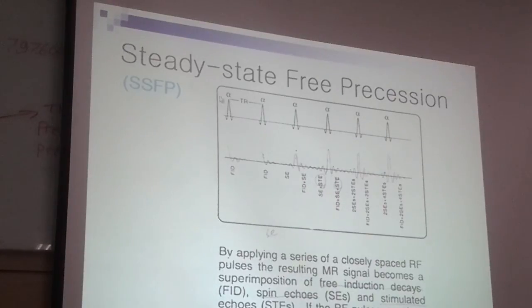After several RF pulses, these signals become steady state. So we call this signal steady state free precession, abbreviated SSFP.